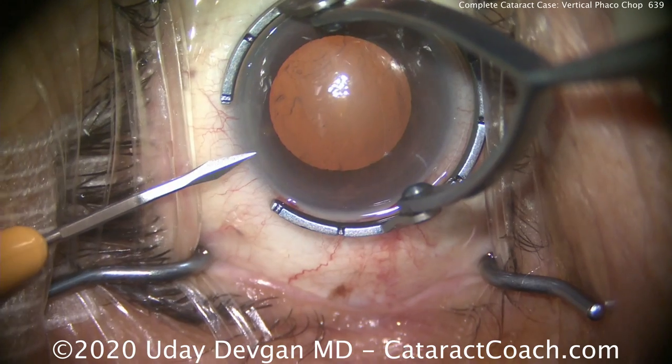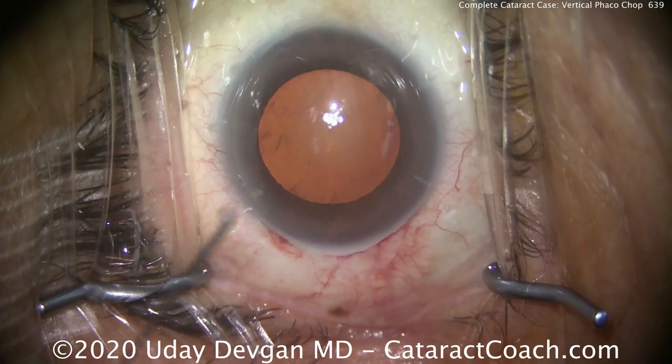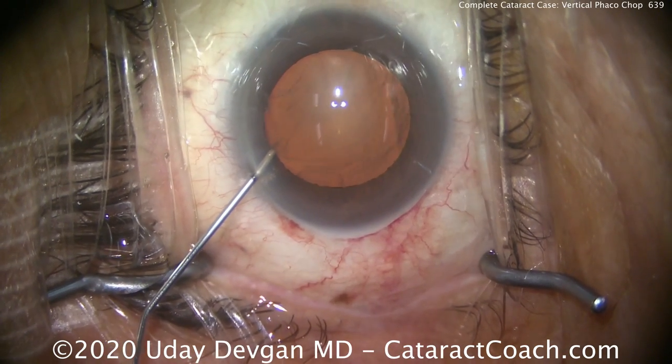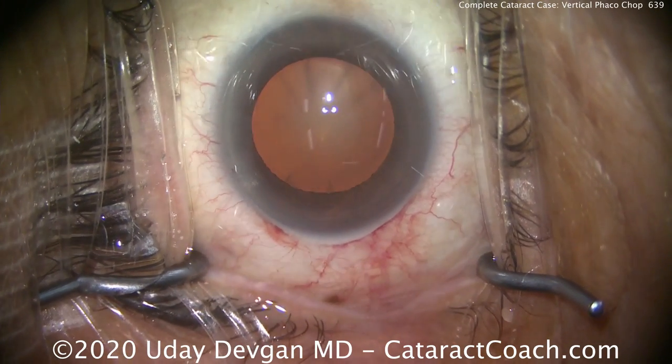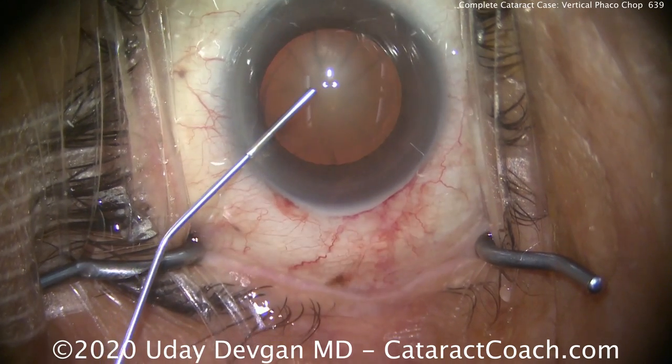We're going to show you the whole case from start to finish. There's a lot of fun in that. A lot of people watch YouTube videos of people playing video games — it's actually fun to watch an expert play a video game, and those videos get millions of views. Well, we're playing our favorite video game. That's called cataract surgery.